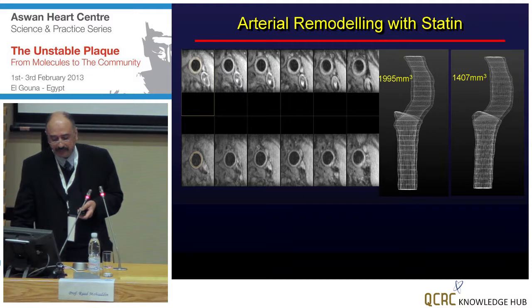I just show you this patient who was part of a trial we're doing, who is totally asymptomatic. If you look, the thickness of the arterial wall is very thick, and you can measure the volume in cubic millimeters from those images. He was put on a high statin dose for at least 9 months, and you see now the change in the volume of that atheromatous lesion.